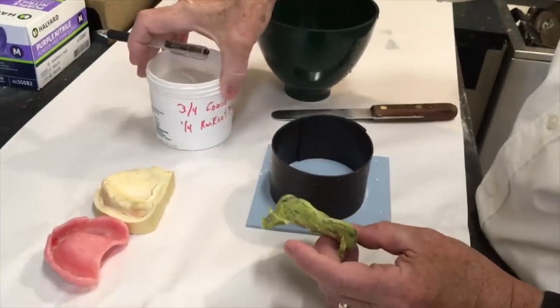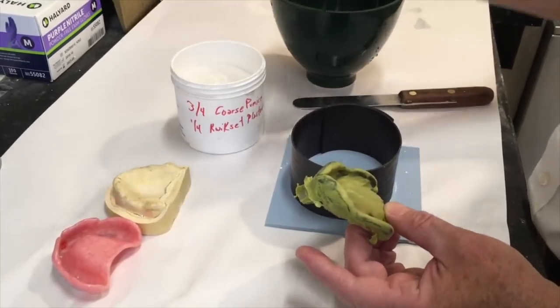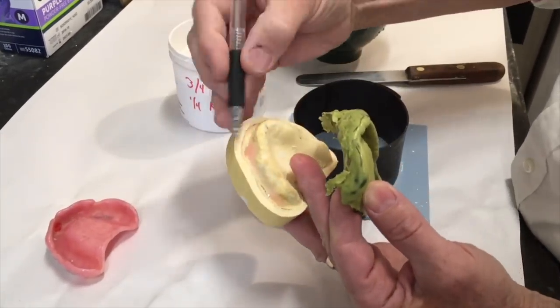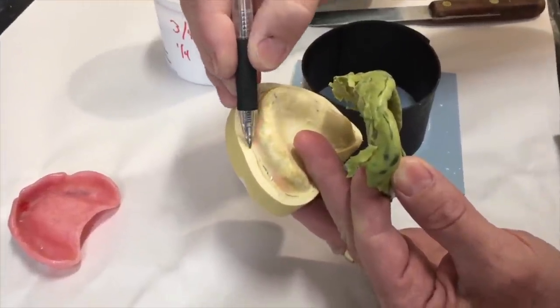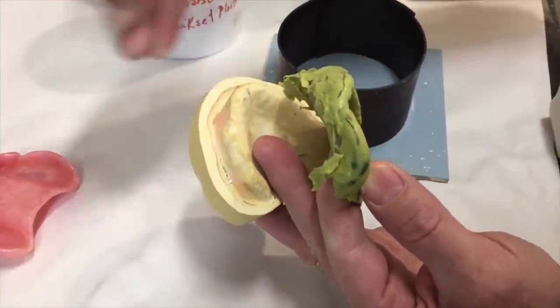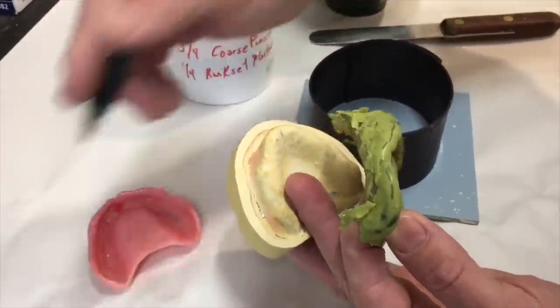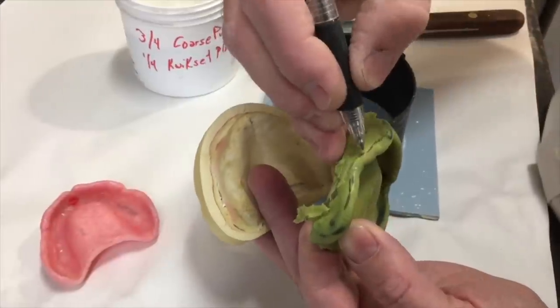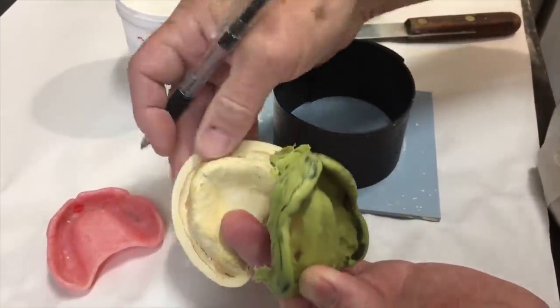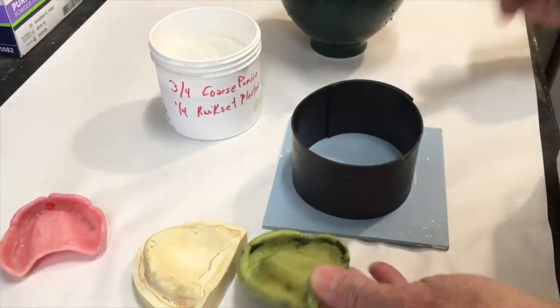We're going to box this impression using a combination of plaster and pumice to create the land area that's going to come out from the cast. Basically we're going to create this part of the land area which defines the peripheral width of our final denture. I want to bury this up to where this line is, and I'm going to use this combination of plaster and pumice rather than wax.